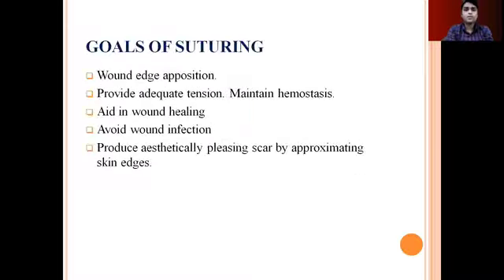The goals of suturing. These include wound edge apposition, provide adequate tension, maintain hemostasis, aid in wound healing, avoid wound infection, and produce an aesthetically pleasing scar by approximating skin edges.